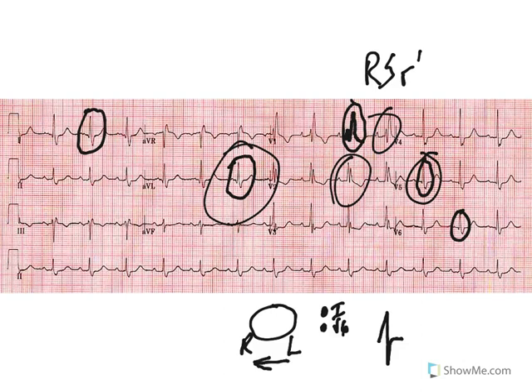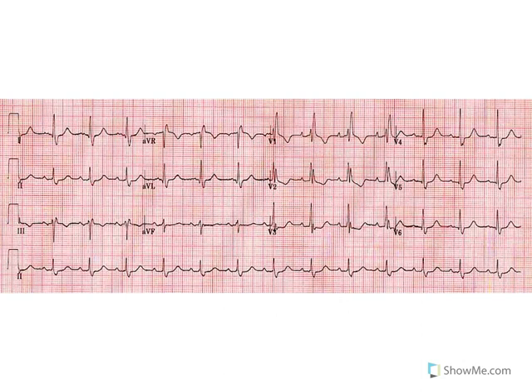So don't just be hunting for bunny ears and carrots sticking in the ground and stuff like that. Okay? Plus, it kind of makes you sound dumb. I don't know. Every time I hear somebody say bunny ears, like, bunny ears, really? You couldn't just figure out on the EKG there's an RSR prime pattern possibly, and then there's an S wave and stuff. But anyway, hey, it's fine. Bill's being William again. I'm trying not to.